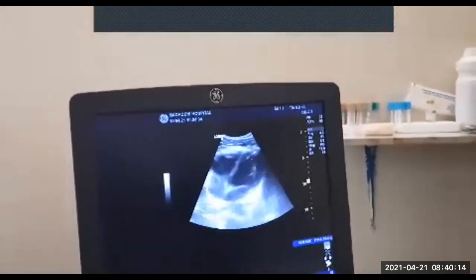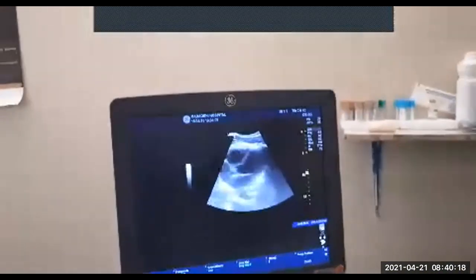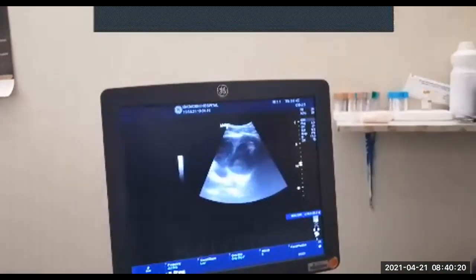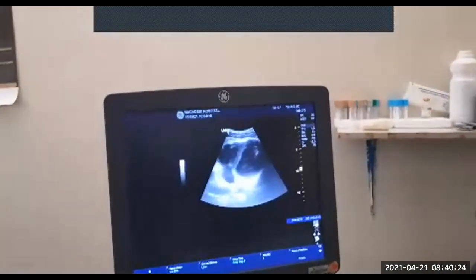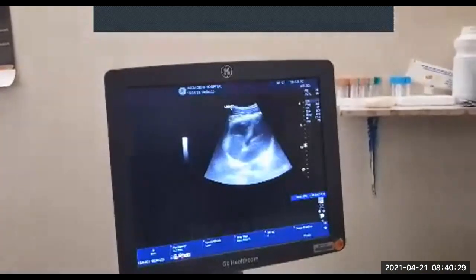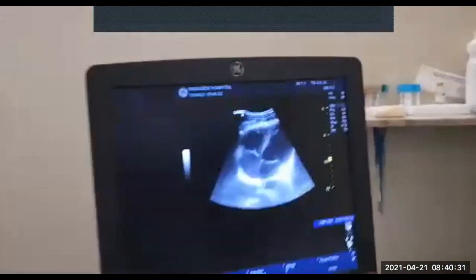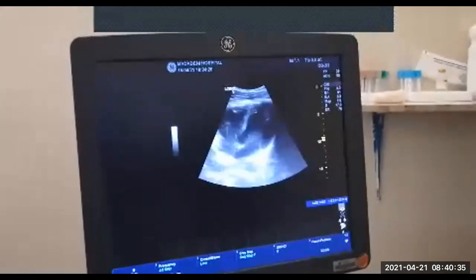Now there are some caveats to that. The patient needs to be relatively fit and in good shape like Malusi is. You can't have somebody with large amounts of breast tissue or adipose tissue. It can become a bit difficult. Sometimes rotation of the heart can make it difficult as well. Ideally, you want the septum to be absolutely perpendicular so that you get correct measurements, but it's not always possible in a real setting.